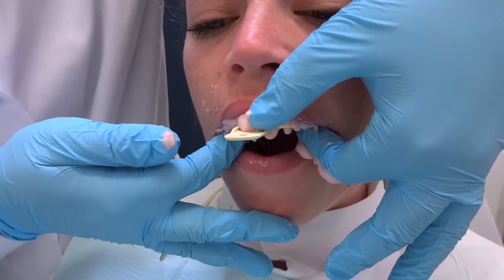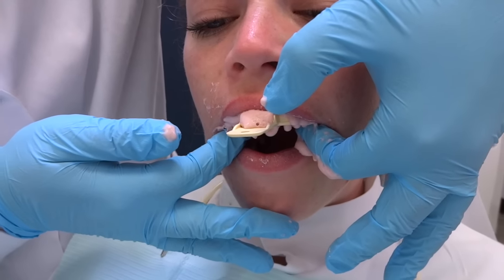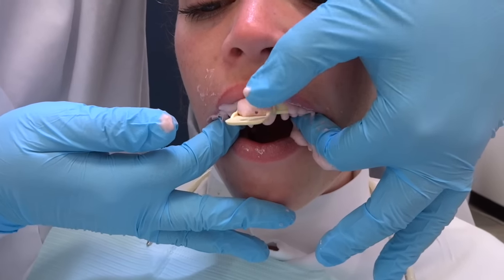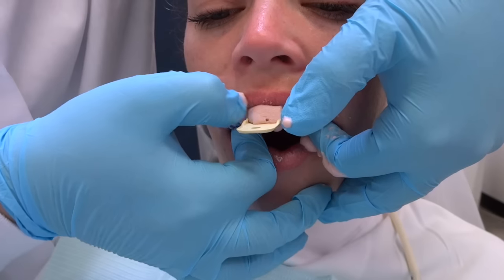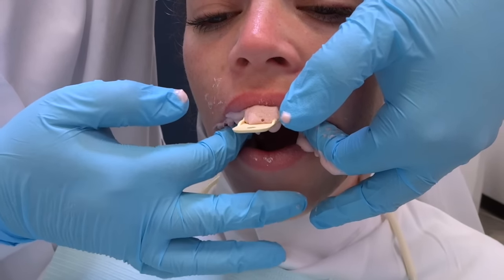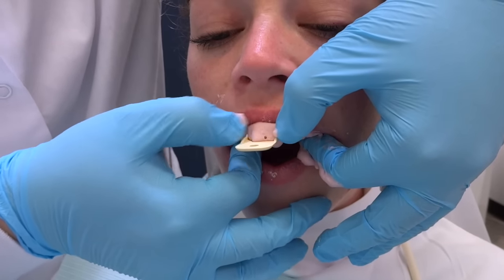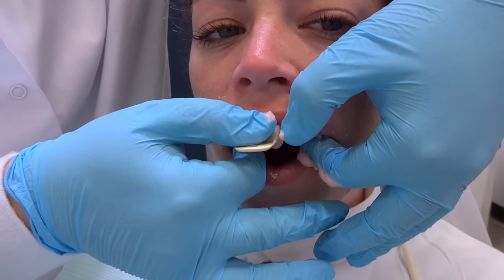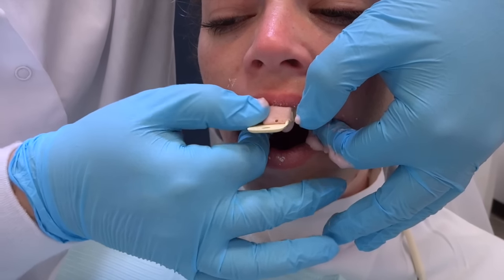While it's setting, keep an eye on the extra material in the front. There are a couple of ways to check if it's ready to come out. You can use your finger — if it still makes an indent, it's too wet. Another way is to use your fingernail; when it won't make an indent, it's ready to go. It depends on your material — some is a quick set of 30 seconds, some is a minute. If you're ever wondering, just read the label on the can.